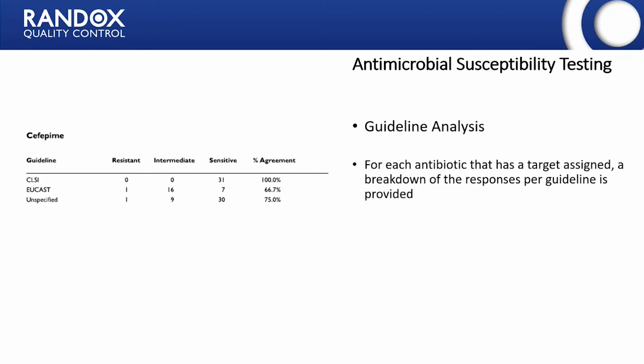Now, some EQA providers will actually provide the actual MIC points, a breakdown of the values that get provided for each antibiotic. We haven't gone down that line, not at this stage. It is obviously maybe a possibility for the future, but at this stage, we don't think that that's as relevant as the information here that we're currently providing.